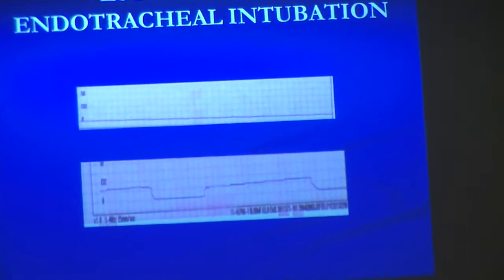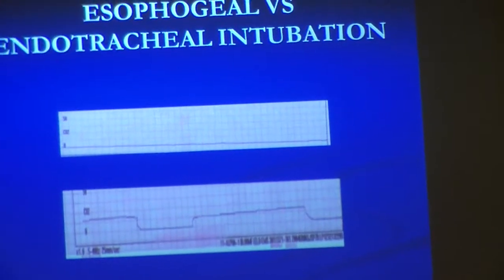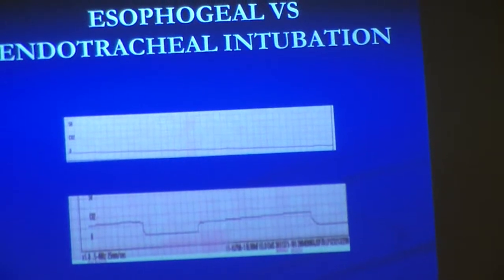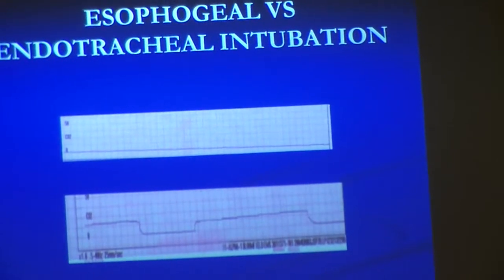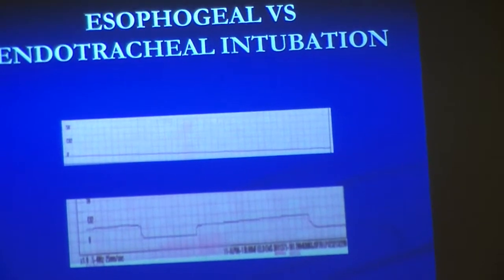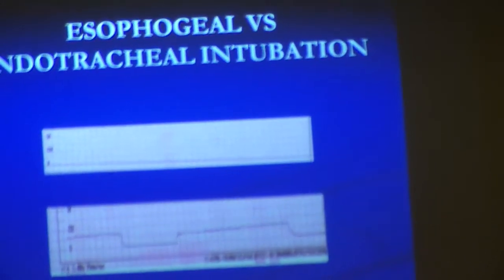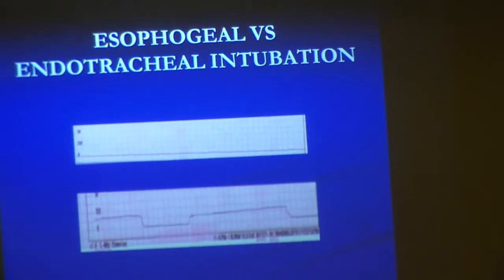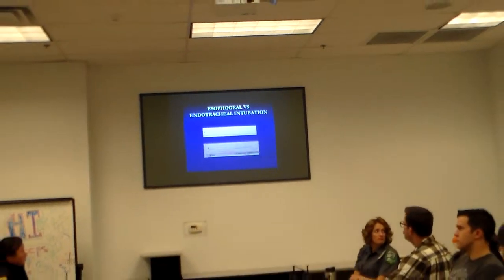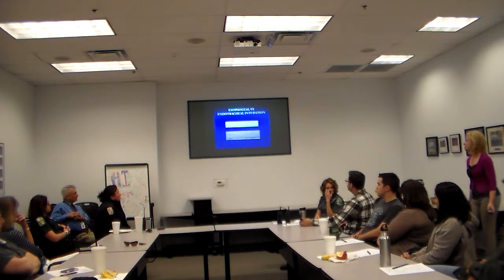Now I have one question, but it's more monitor related. So if we highlight end-tidal CO2, so we're reading it on the screen, when we print a strip from that, does it show up? Do we know? Yes, it does. But not in a code summary. You have to hit snapshot in the summary, but if you just hit record and you have it on screen, it'll give you the waveform. It doesn't come on summary at all, only if you hit snapshot. Side stream would be the same. So just do a snapshot or push the button, or get someone else to push it, so you've got a strip for yourself and then put it on your PCR.